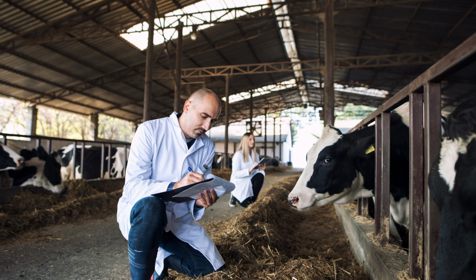And then it's of course very important that you perform it correctly. We have discussed that previously, that broth microdilution is our reference method for antimicrobial susceptibility testing. But it's not a magical method where you always get the correct results. You have to follow the methodology, and that includes the reading instructions.